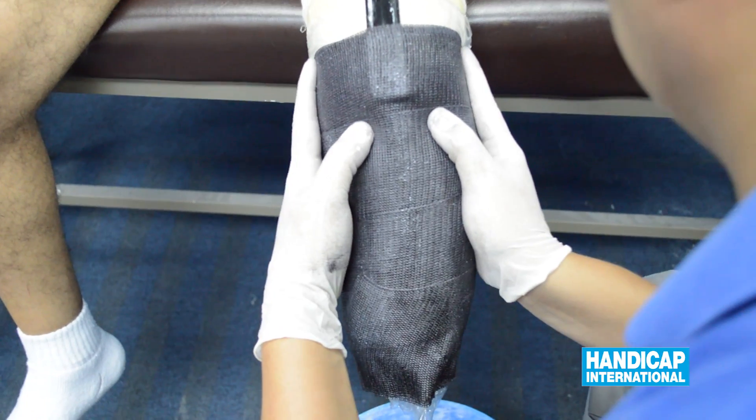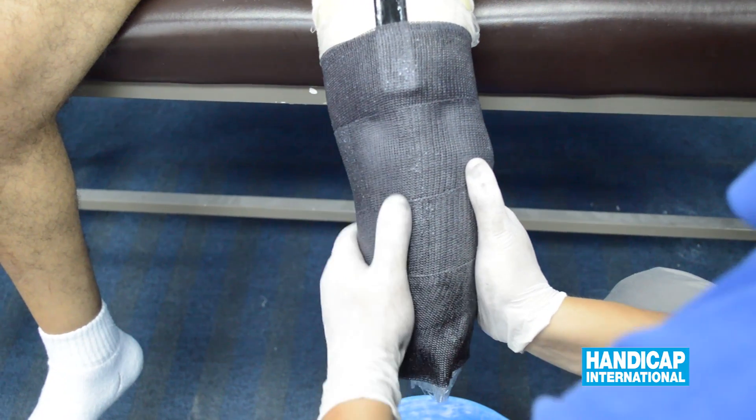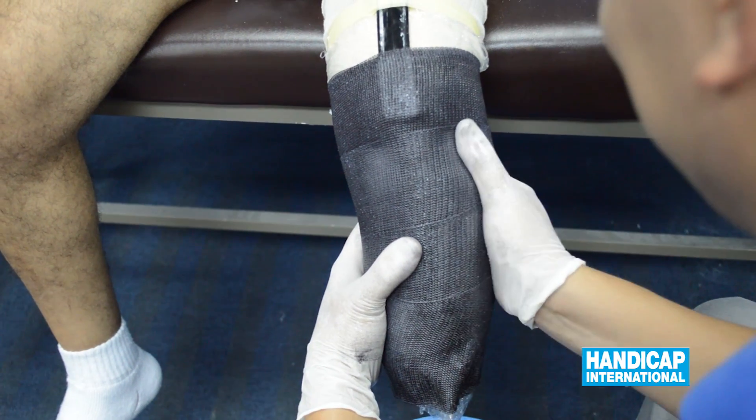Form the socket and apply pressure to the patellar tendon, the medial and lateral side of the tibia, and form a triangular shaped socket to avoid rotation.